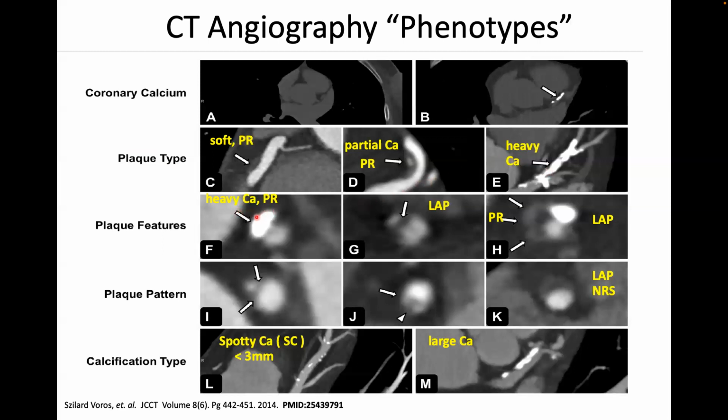So here's an example of heavy calcium, right? As seen not along the vessel, but in a cut that is axial to the vessel. But you can still see at this point, we have enough lumen here. We don't have a problem, right? We know that is okay.